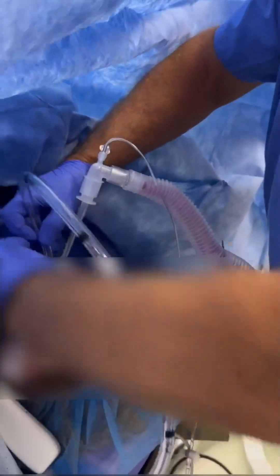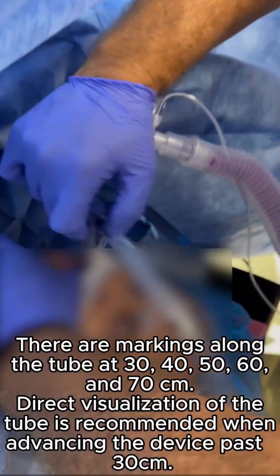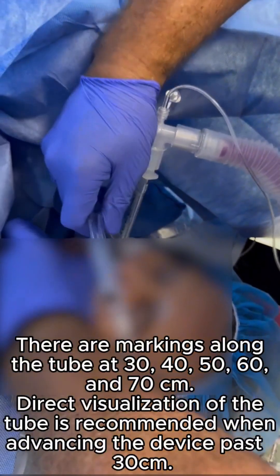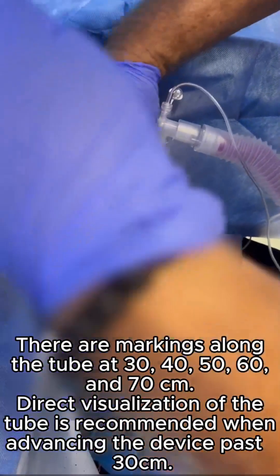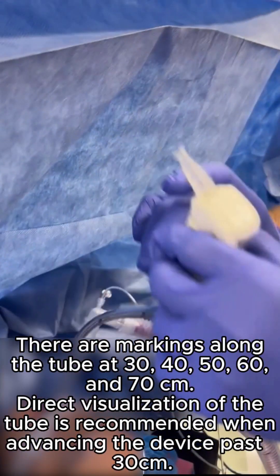Stop if resistance is felt. There are markings along the tube at 30, 40, 50, 60, and 70 cm. Direct visualization of the tube is recommended when advancing the device past 30 cm.